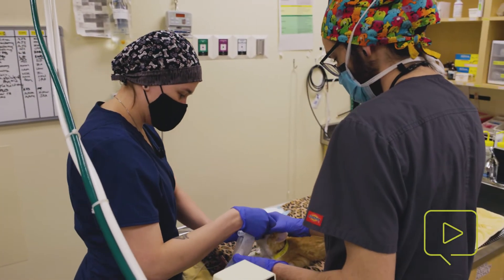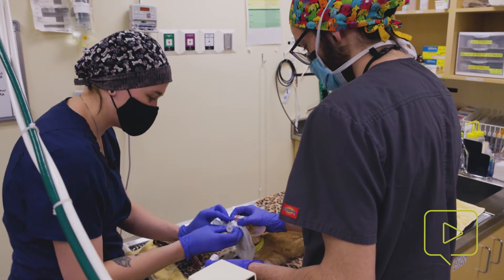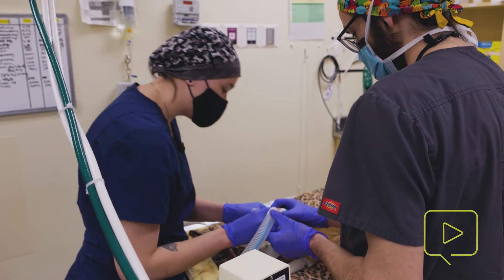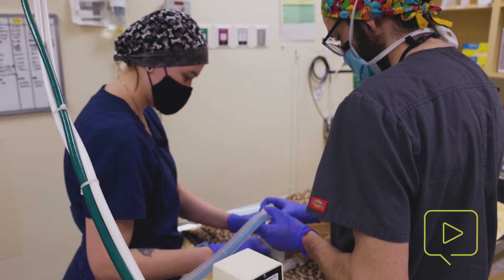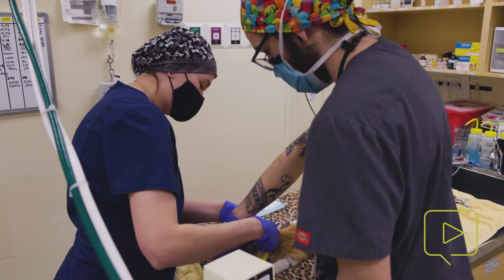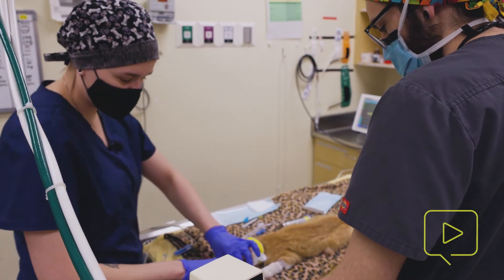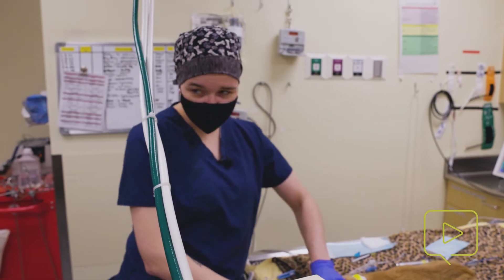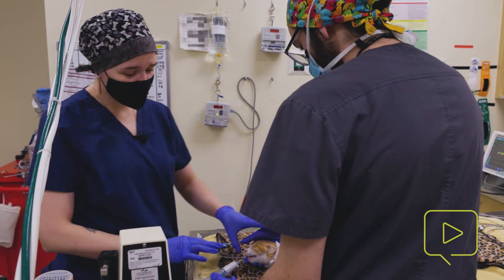We're going to secure our tube. If there is a cuff on your ET tube, make sure that you do not catch the inflation line or you will obstruct that flow. In kitty cats, we usually tie behind the head. If you're doing a scope, you might tie it to the bottom jaw. But because they don't have much of a muzzle like dogs do, you can't typically tie it on the top of their mouth. We're going to confirm our placement here and then we should be ready to start our procedure.